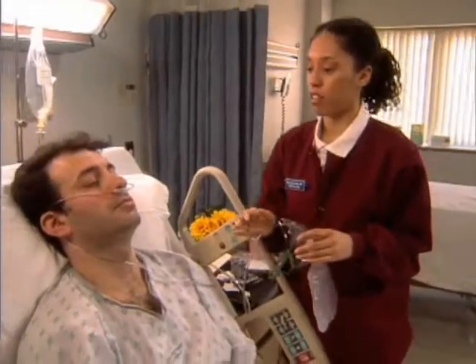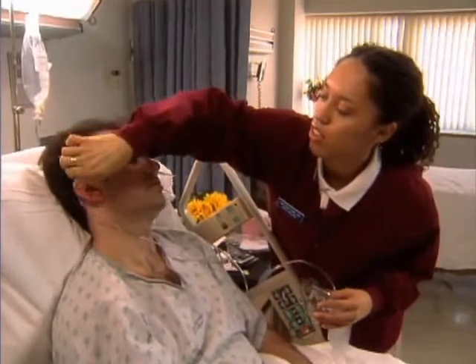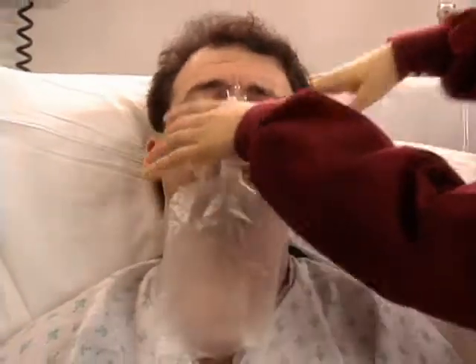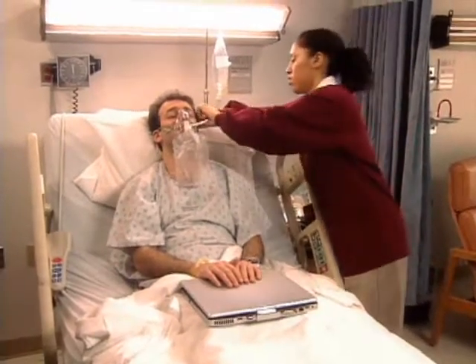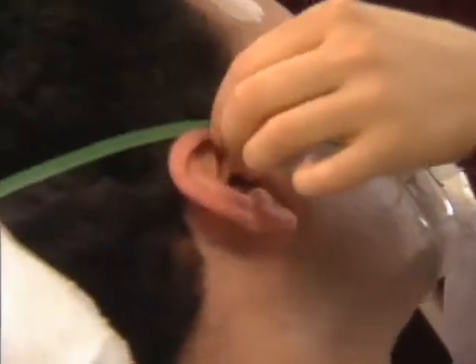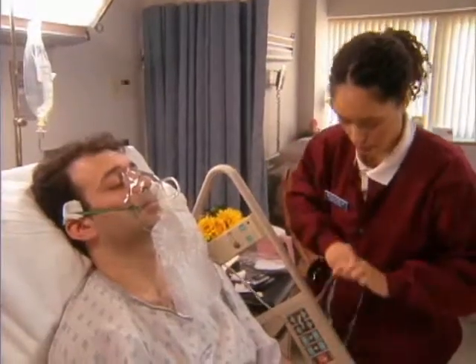Okay, I'm going to put the mask on you now, Mr. Simon, okay? Okay. We're just going to take these out. Right. Lay that here. Put this on you. And it's here to protect your ears. Can you look at me? How's that feel? All right? That's it.